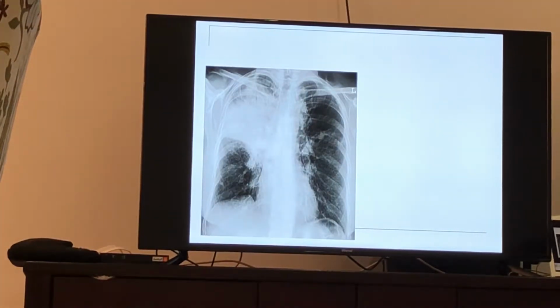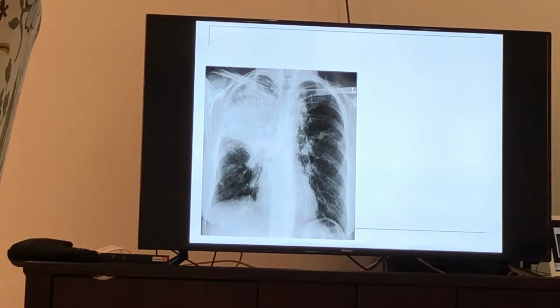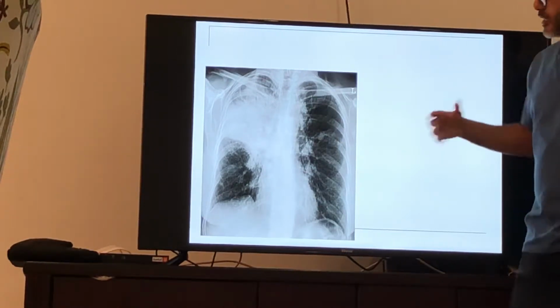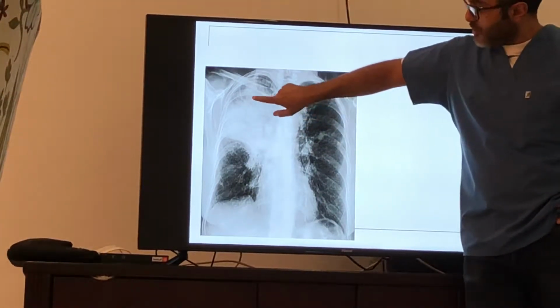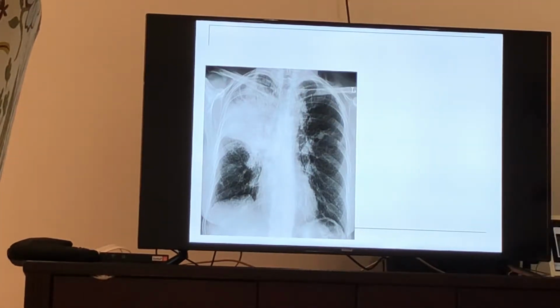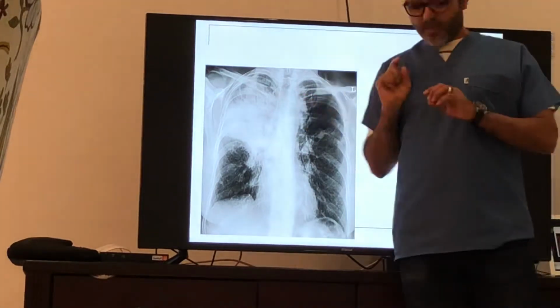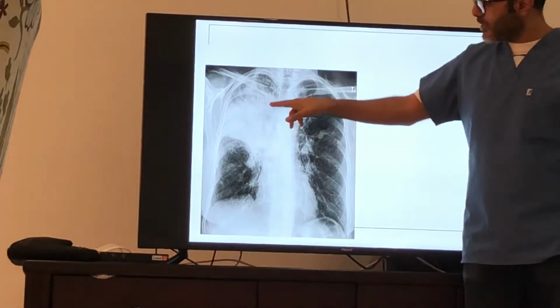What about this? Patch in the right upper lobe. Yep. Increased vascularity in both lungs. So thank you for saying patch. So here what happens is it's still an air bronchogram. This air bronchogram is amazing. You can actually draw the vessels. Not all the vessels, of course. This is 2-dimensional. So we're just seeing the vessels that are going up, but there's many vessels going to the back and going to the front. We can't see them. They're going to be rounded. And when you take a slice, if there's a vessel going like this, it's gonna be rounded. It won't be shown, but those are well shown, as they're going up.